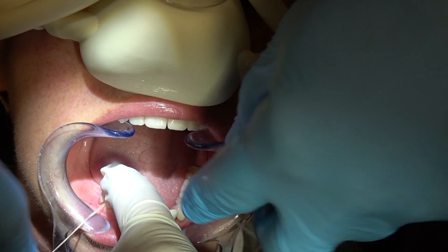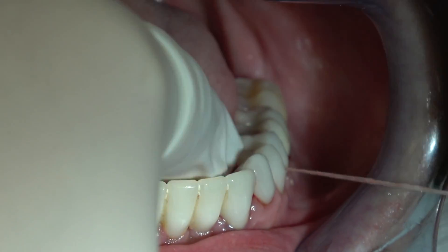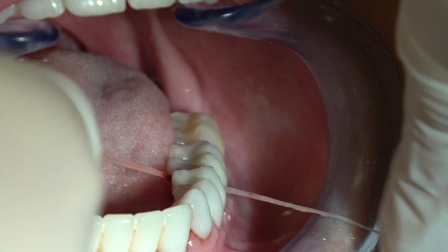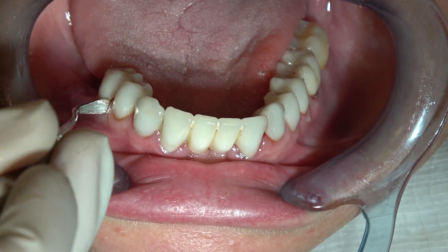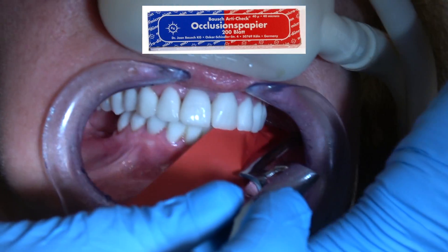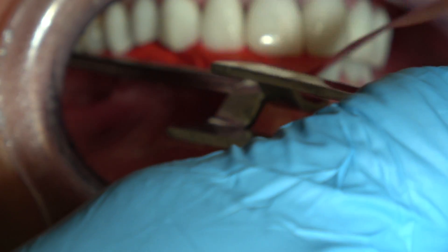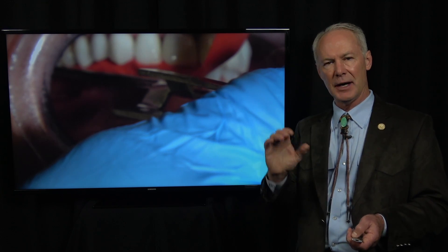You do want to go ahead and pop floss in the interproximal contact so cement does not set up there. Now the cement has reached initial set. We're popping that floss through. Then you're going to chip off or break off the excess cement, then wipe it with a cotton ball. We're going to check our occlusion, and I like to let the cement set for about 15 to 20 minutes before I check it. If you check it too soon and there's a prematurity, you may break the cement bond and the crown may come loose.